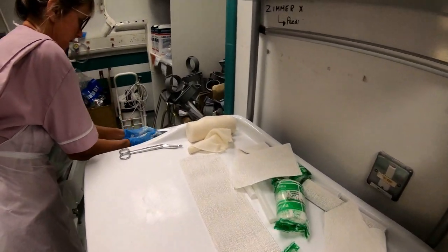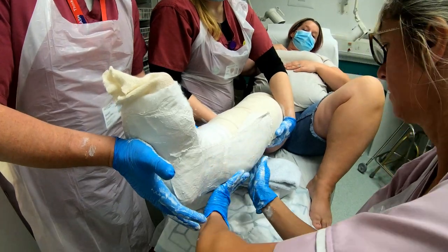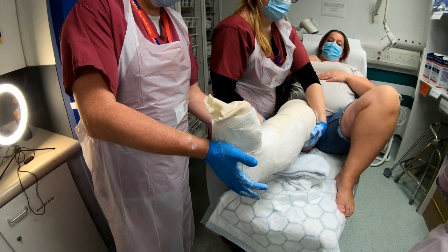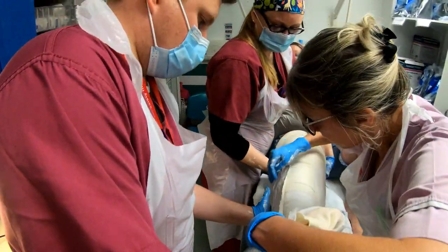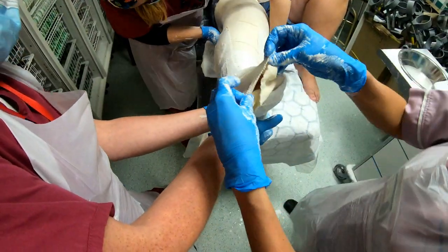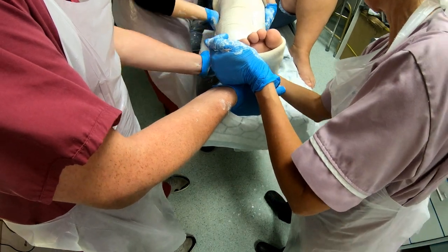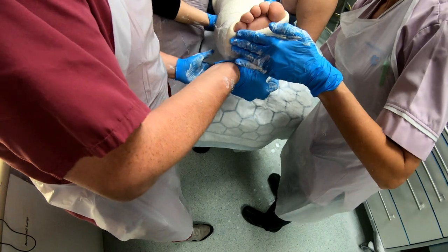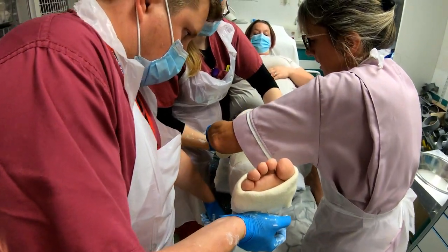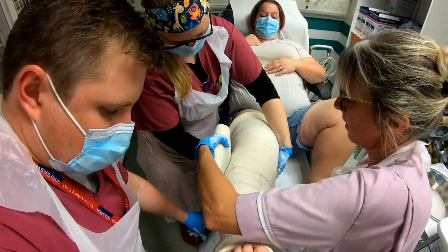Now the two stirrups for the below knee — squeeze, line it up just to cover the ankle, and one for the other side. We can then start putting the bandage on, making sure we've covered everything and covered the lower plaster as well. Then we turn the sock back, exposing the toes — that's nice. We've also got a nice 90 degrees of the foot. Keeping that pressure there, then we'll just finish off with the next bandage. You don't actually have to wet these bandages — with crepe it's entirely up to you; you could wet them if you wish, but it doesn't need to be.